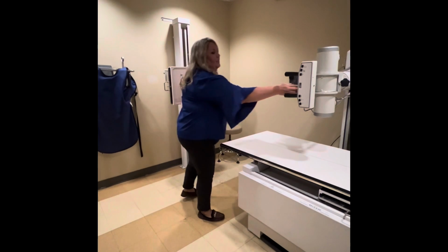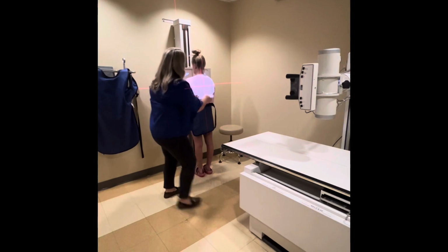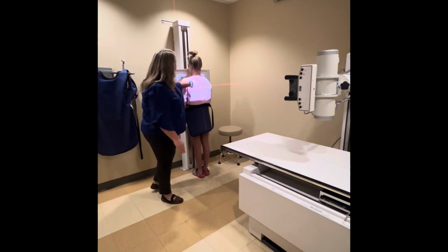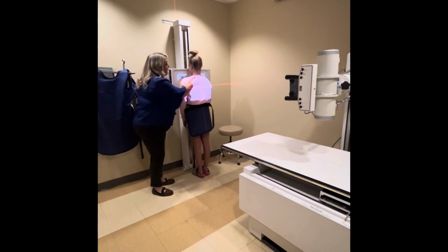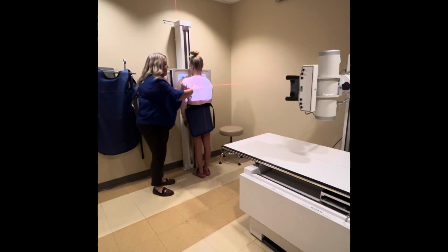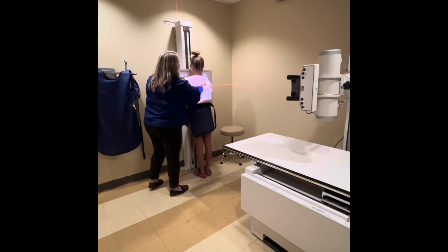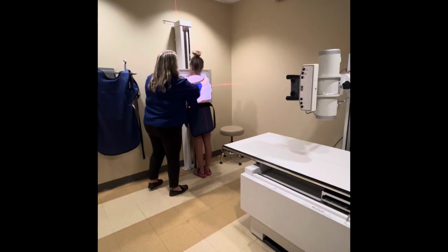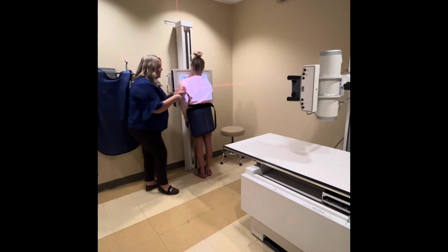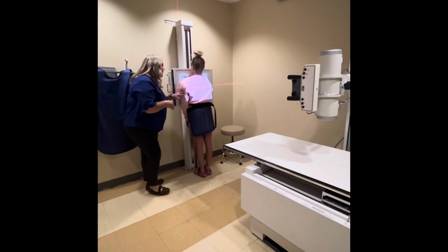We also want to make sure that our central ray is going to enter at about the level of T7. So we are about the level of T7. I'm going to have her scoot all the way up. The central ray is also going to enter the midline of the patient's body. So I'm going to take my hand, I'm going to feel her spine, and I'm going to make sure that we're lined up with her spine. So also what we're going to do now, we're going to have the patient roll their shoulders forward, depress and roll. When we do that, that gets the scapula out of the lung field like we talked about previously. So now her scapula are out of the lung field so that we're not superimposed over the lung.